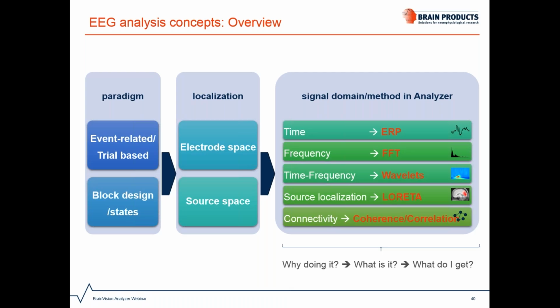Furthermore, I will show an example pipeline in Analyzer, and I picked out some example publications which use these methods implemented in Analyzer. Please understand, in this webinar we can only give very basic information on each point, so rather see this as a teaser for going further into the topics. Also, please consider this when addressing questions at the end. Further reading is required to carry out the demonstrated analysis. Please also check regularly for upcoming webinars featuring these topics.